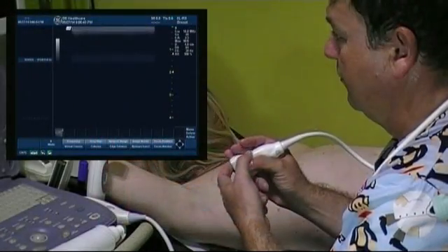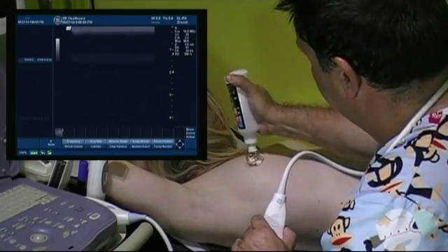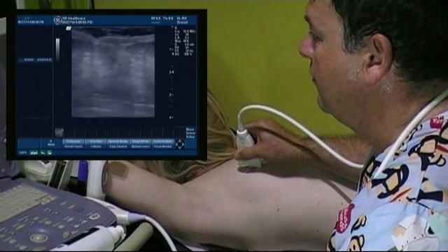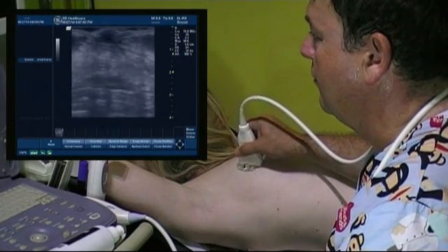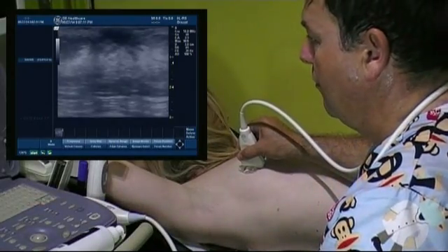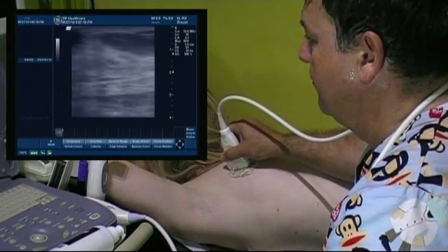We start by applying an amount of gel to the nipple which we will later spread across the whole breast. First we take a good look at the nipple area. This will give us a good image of the size of the breast and we can estimate the distance between the skin and the pectoral muscle. Knowing this we can apply zoom to our screen in order to maximise the field of view. At all points of the examination we should make sure that we have a good view of the structures between the skin and the muscle, holding the probe vertically to the skin following the shape of the breast.